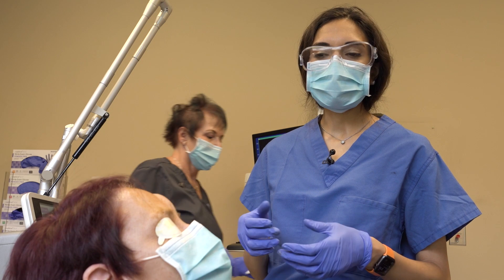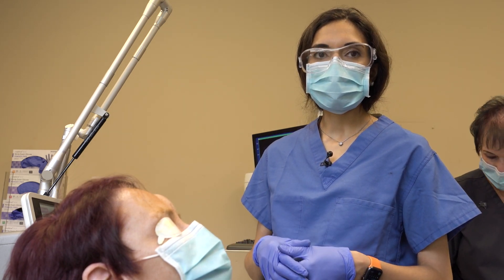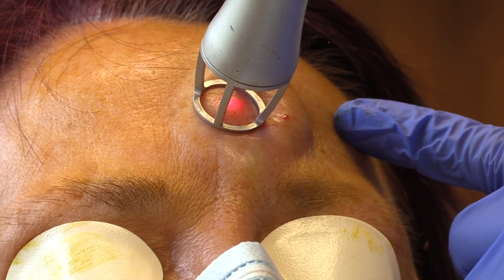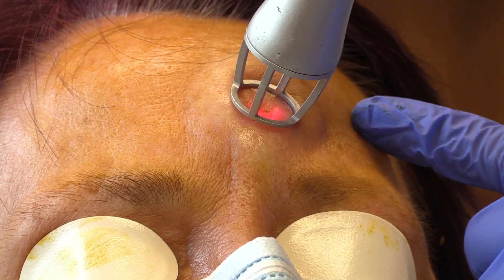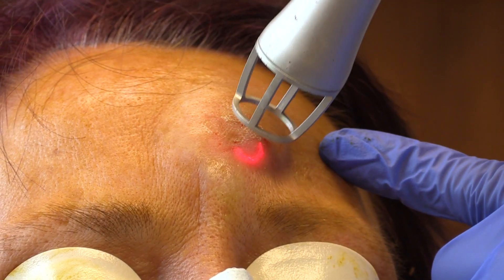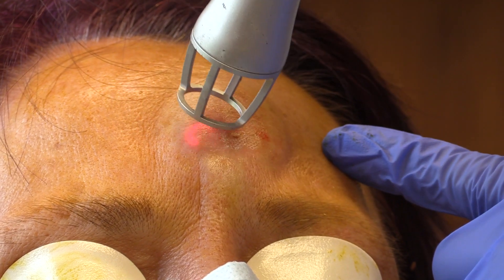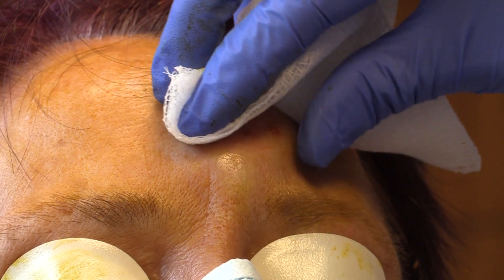Typically the laser needs one to two passes. Because this is a slightly deeper scar, we're going to go ahead and retreat the same area with the laser — just like a stamp. The laser heats areas of the skin and this stimulates the body to generate more collagen. Once again, the char is wiped away.